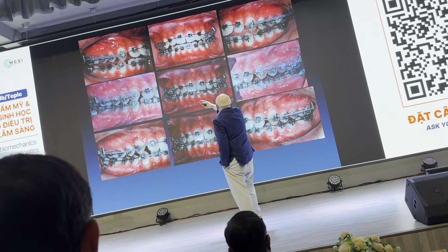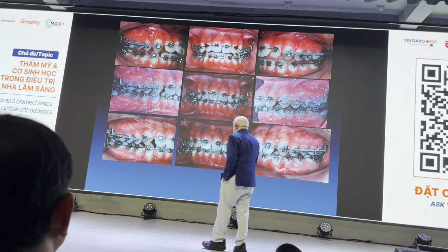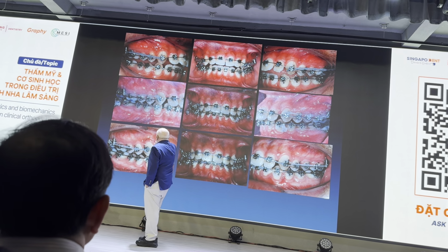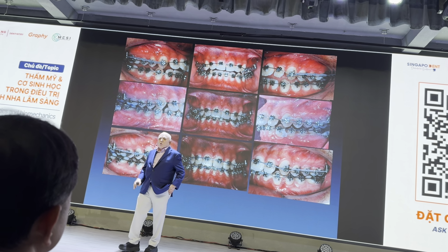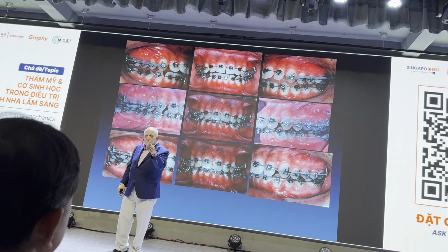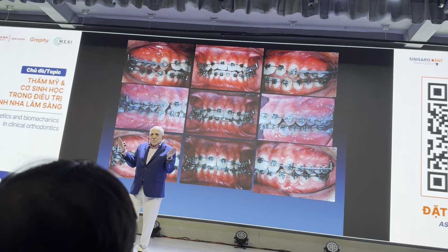we have put in infrazygomatic tag only on one side. And what we are going to do is we are going to retract the canine and put the molar into class 1 position before we change the midline. Don't work with the midline because there is no space to change.